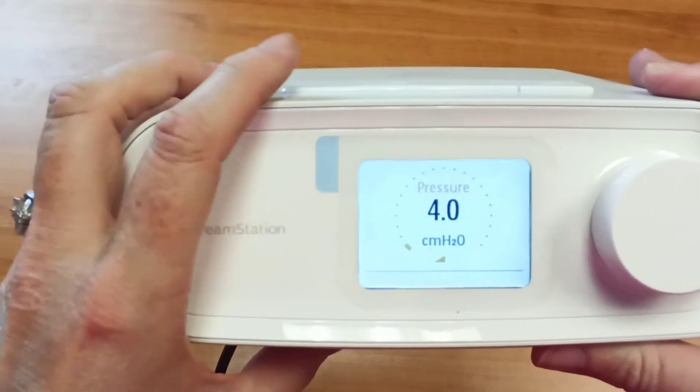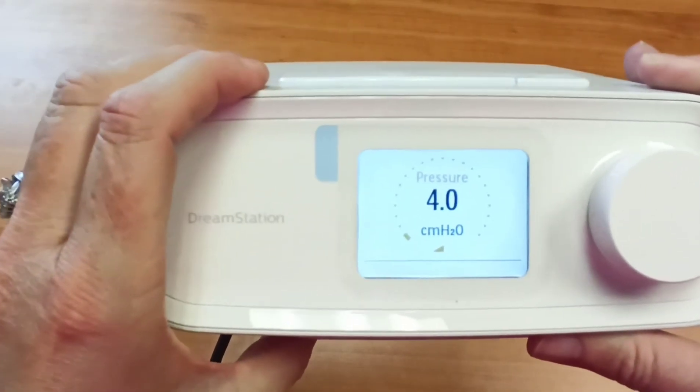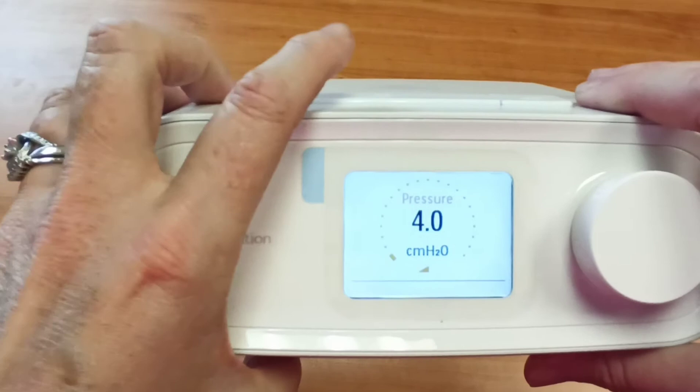Now, if you fall asleep and that's it, when you wake up, you just hit the button to shut your machine off and you'll see that it had already gone back to your pressure. But if you're not asleep, you can hit your ramp again and renew it back to four at any time.